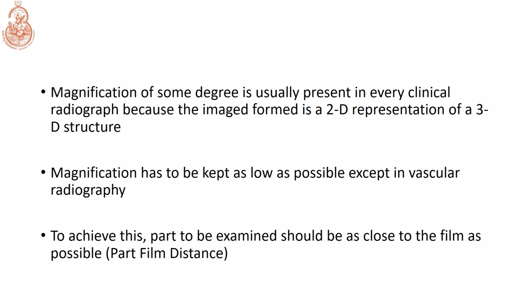So when we make one such thing, there can be some degree of magnification in almost all the clinical radiographs.